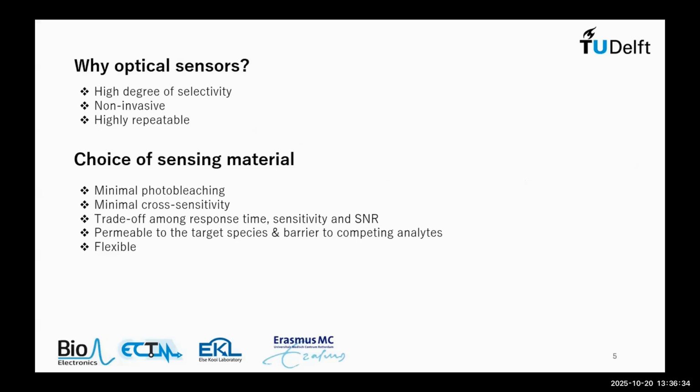So why optical? Well, we can get a good degree of selectivity. It's non-invasive, highly repeatable, and highly reversible as well. We have to look at possibilities of photo bleaching, which could affect the signal you're getting. We have to minimize cross-sensitivity, trading off between time sensitivity and signal-to-noise ratio. This is something we're not talking about here, but we need to look at. We use a permeable layer so that the oxygen and the hydrogen ions can get into our device, and it should be flexible, so it fits very nicely to the organ.